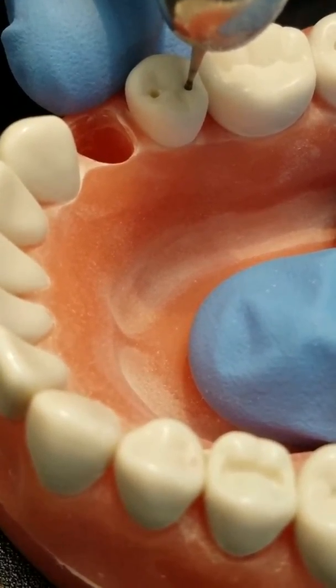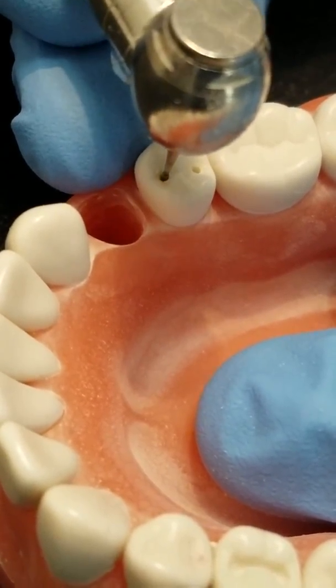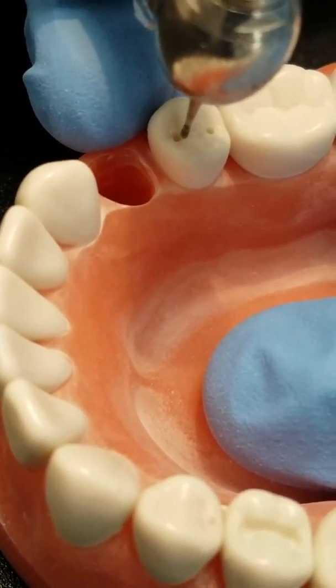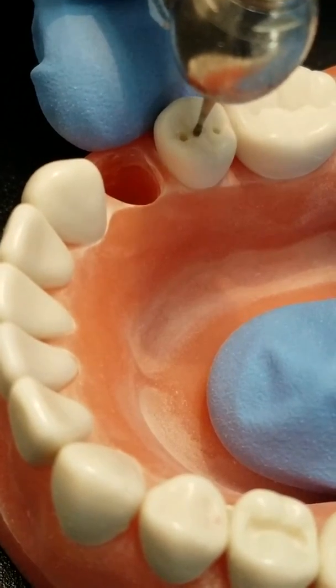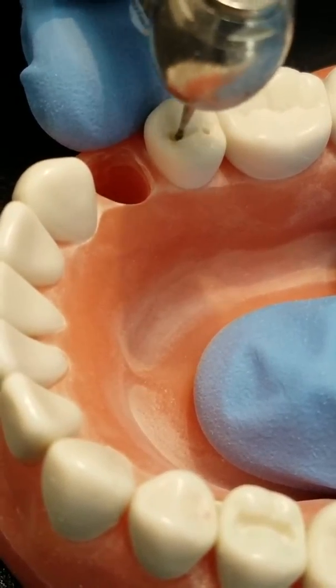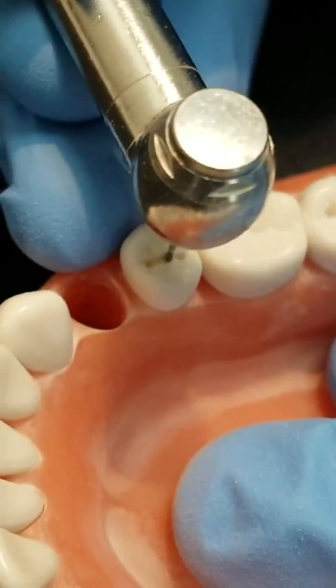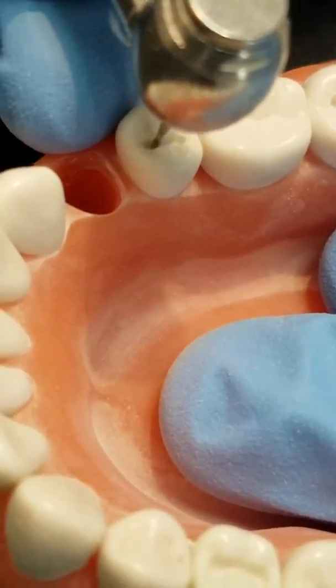Here I've made my holes at the groove pits, and as you'll notice this is the only place in the entire video where I'll be going full speed on the high speed — I'll explain that in a moment. Here I've got the basic outline of the central groove line.